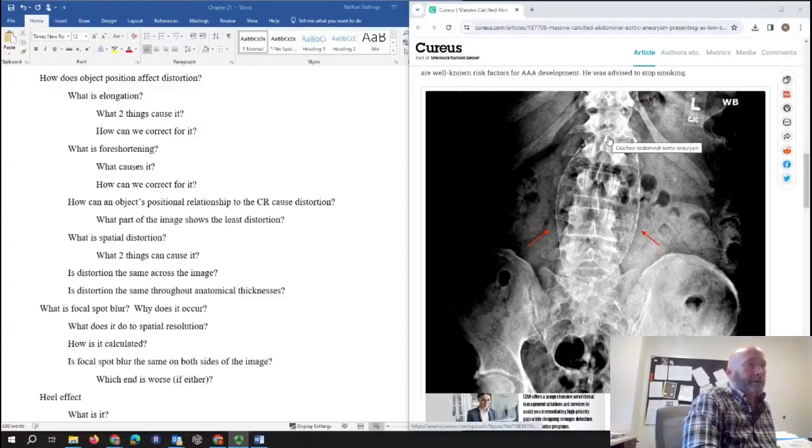It was actually the perception was exactly backwards, with an abdominal aortic aneurysm, which is what we're looking at here. The aorta runs directly anterior to the spine, and this area of calcification here is your aneurysm.